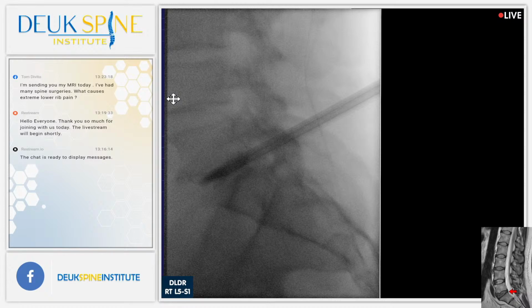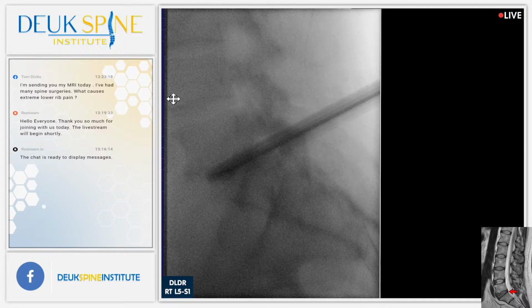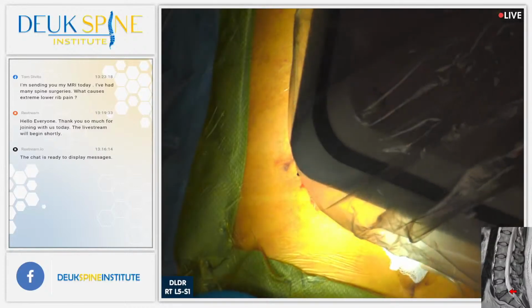Is that sterile? I like it. It's okay? Of course, I put it like that. That's for my guys. Oh, I know what it is, but alrighty. Come out. Should be good. Shot? Oh yeah, we're in good. That's fine. As long as it's appropriate, okay.